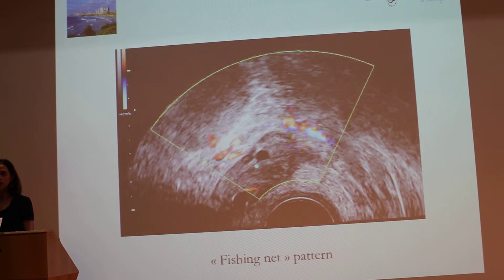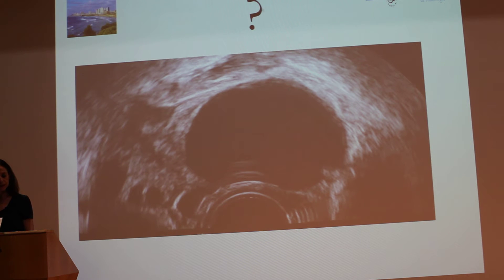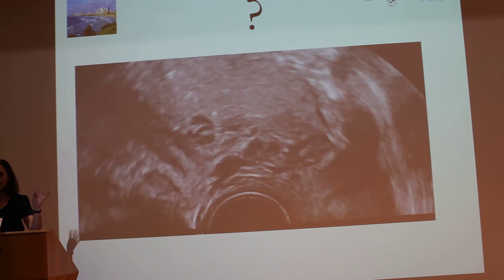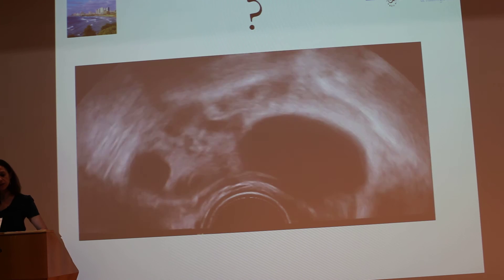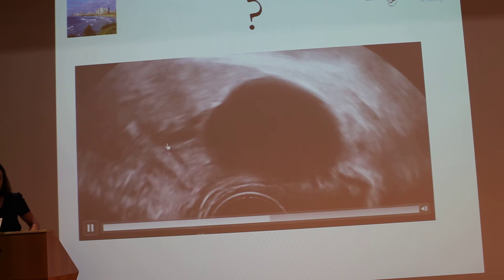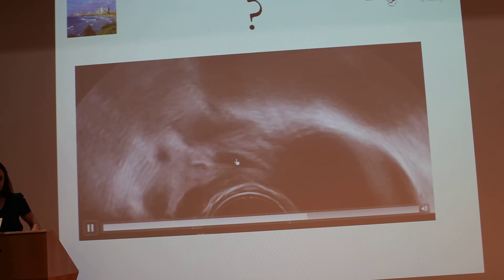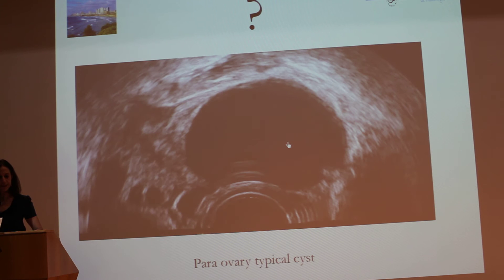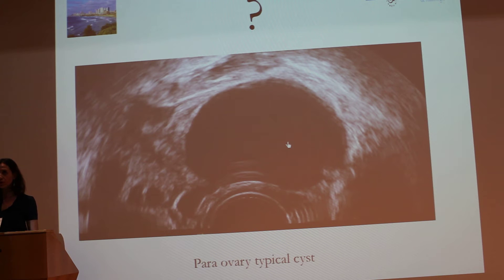When you are in front of this typical pattern, you don't need to perform MRI. In another situation shown in this clip, a patient with acute pelvic pain presents with this cyst. Managing the exam with the other hand, you do compression between the ovary and the cyst and can see there is a separation — they are a separated ovary and cyst. So this is a para-ovarian cyst, and there is no need for surgery and no need to perform MRI.